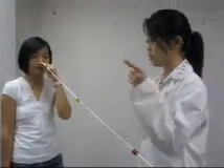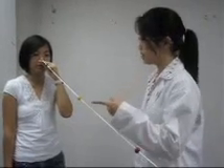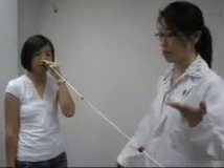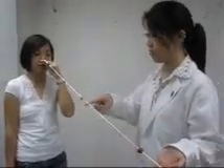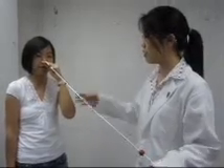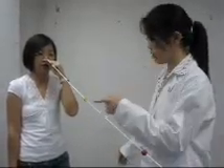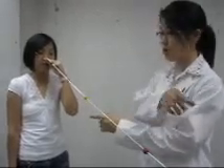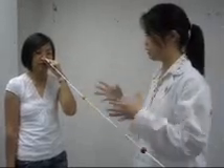Now please focus at the yellow bead. How many of the yellow beads do you see? One. Focusing at the yellow bead, how many of the red beads do you see? Two. Still focusing at the yellow bead, how many of the green beads do you see? Two. Focusing on the yellow bead, which is larger — the separation between the red beads or the green beads?